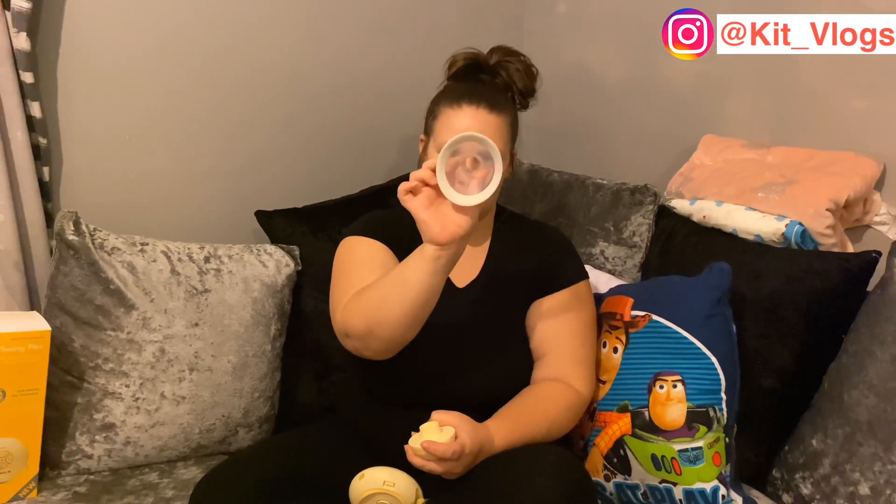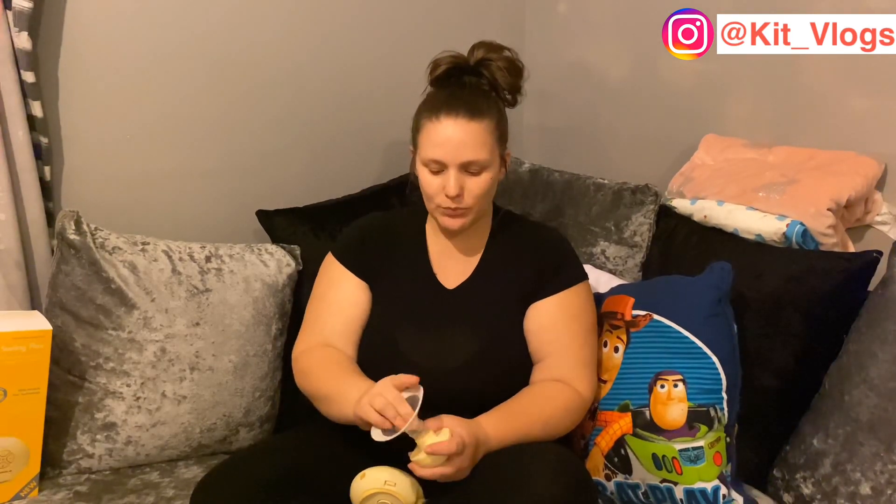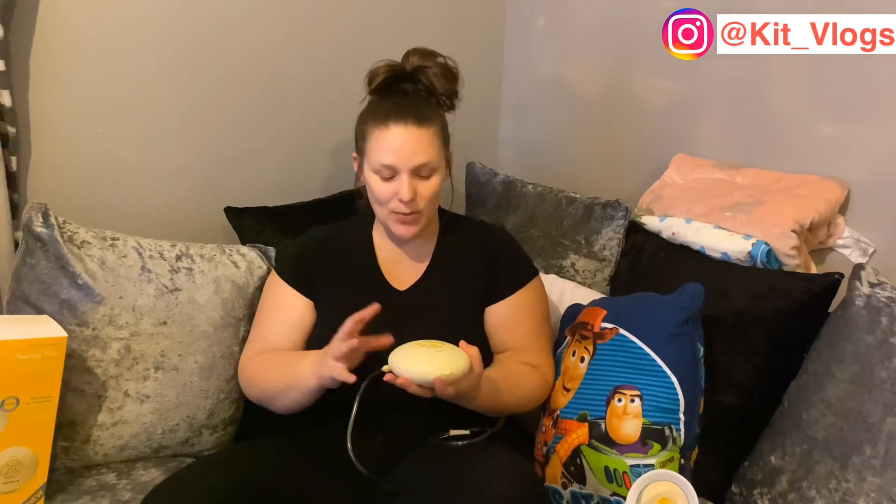It comes with two different size flanges — this one is the 24 millimeter — and you can buy different attachments for it. People have said it's silent, but it's not. So if you want one that's silent I wouldn't go for this one. It gets the milk out efficiently though, and if I'm out and about and people hear it, I'm feeding my child — I really don't care. I'll insert a clip of it pumping so you can hear the noise it actually makes.